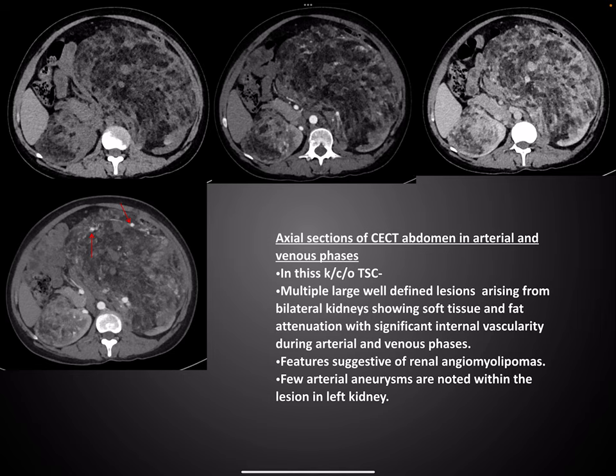Another patient presented with gross abdominal distension. Axial sections of CT abdomen were taken in arterial and venous phases — a known case of tuberous sclerosis. Multiple large well-defined lesions arising from bilateral kidneys are noted showing both soft tissue and fat attenuation with significant internal vascularity during arterial and venous phases, features suggestive of renal angiomyolipomas. The maximum intensity projection (MIP) image also shows arterial aneurysms noted within the lesion in the left kidney.